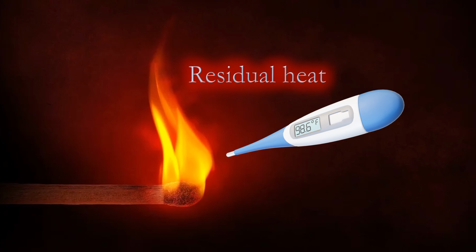Energy devices can maintain heat at their tips for a variable time after deactivation. Some studies found that ultrasonic energy instruments have a higher residual heat than electrosurgical instruments. Surgeons should avoid touching vital structures with the tip of an electrosurgical device immediately after deactivation. If the bowel is inadvertently touched with a hot device, it should be examined for blanching, and suture should be considered to avoid delayed perforation.